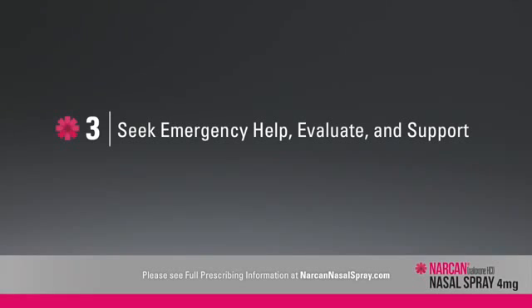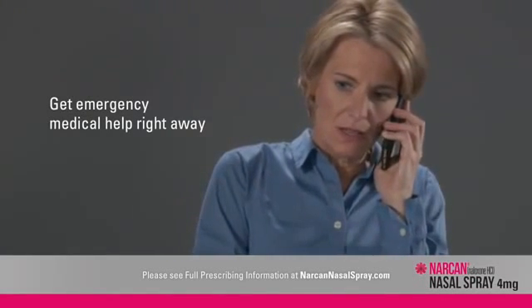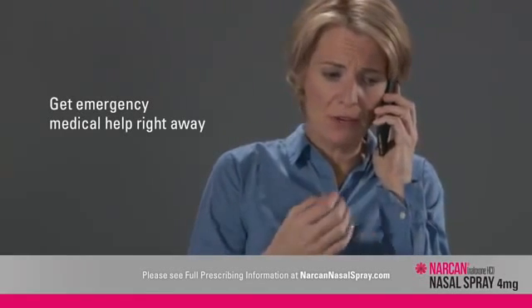After you have given this medication, seek emergency help right away. NARCAN nasal spray is not a substitute for emergency medical care. I'm with somebody who stopped breathing. I think they've had an overdose.